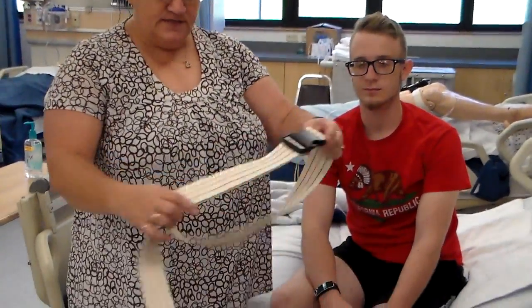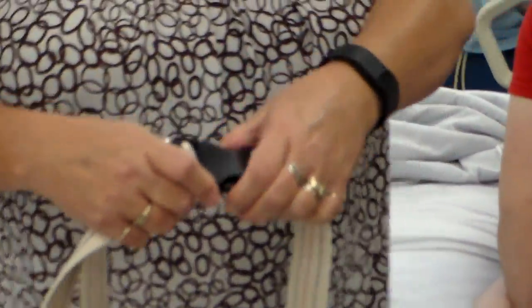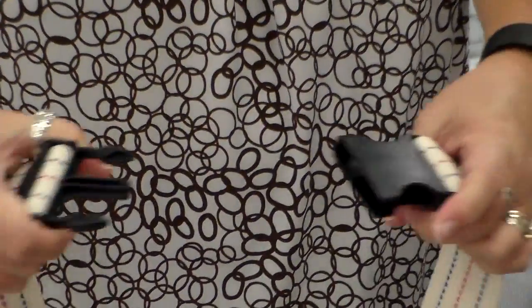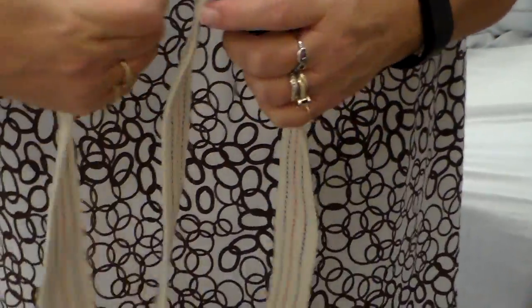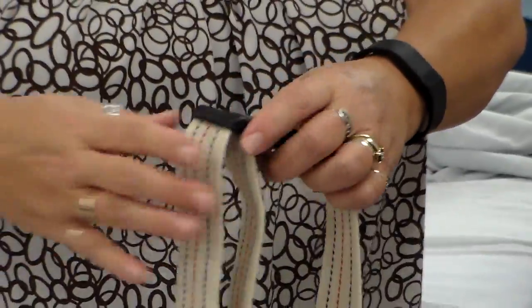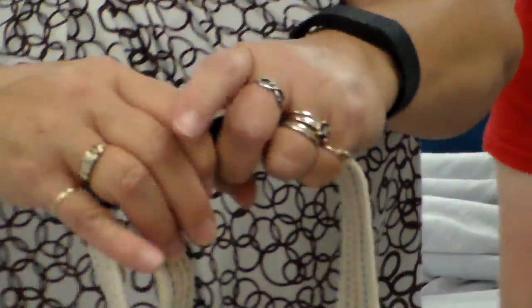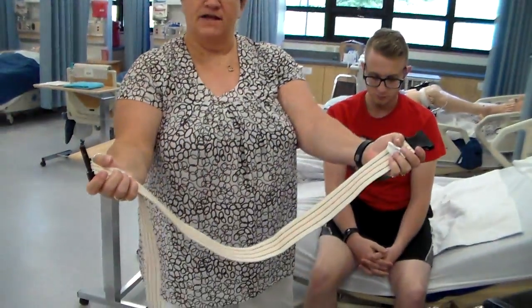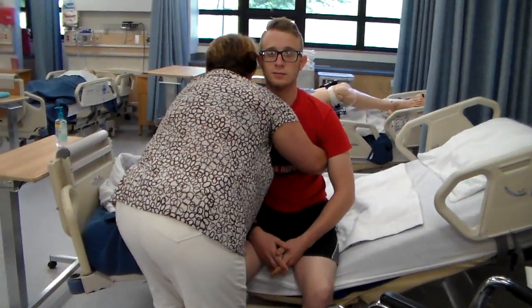Okay. So this is what we call a transfer belt. And there's all different kinds. This one is a snap closure. It just looks like this. You just push it in until you hear it snap. There are some that you actually have to feed through, and it's a metal, you've all seen them, the brackets that I'm talking about where you feed this through and all that. This one is a simple connection like that. What we're going to do is put this around our patient.